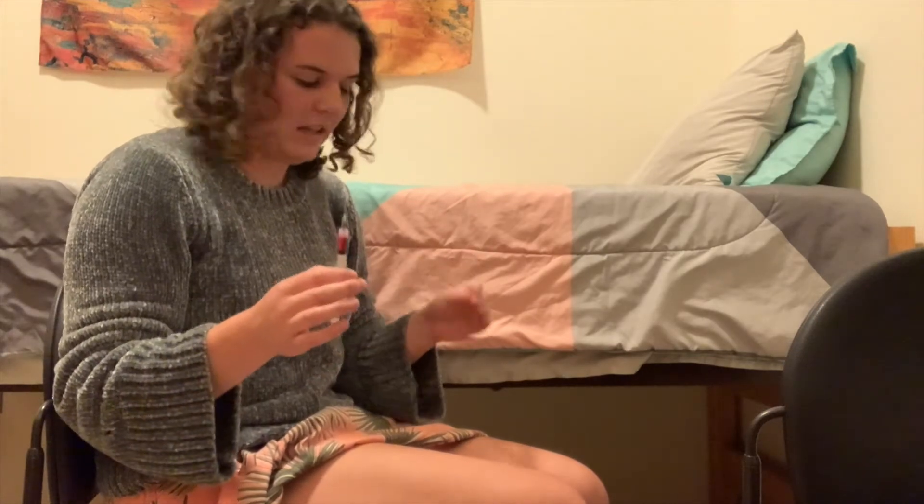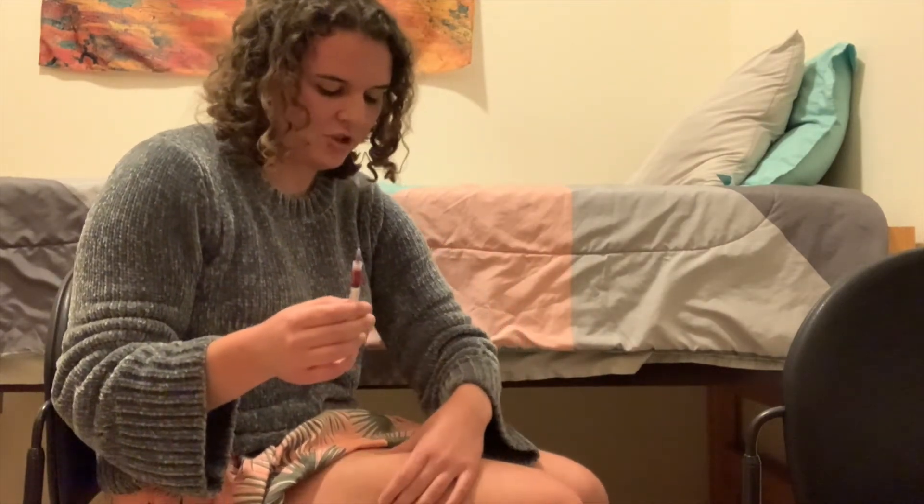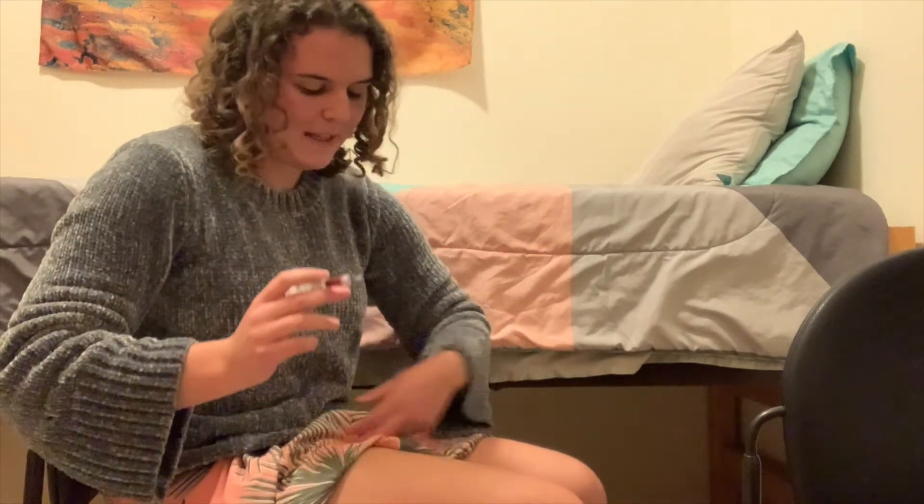Remember, we don't want to inject straight on top of our thigh — we want to go a little to the side. Make sure that your muscle is relaxed, then grab it and pinch it gently. You want to insert the needle straight down at 90 degrees — do not put it at an angle. Once it's in, insert the liquid by pushing down on the plunger slowly until it's all in. Then wait three seconds and draw the needle straight out. You shouldn't even bleed that much and it doesn't really hurt. So, my leg is relaxed, I'm going in on the side, slightly pinching. One, two, three — slowly inject the liquid. Once you have pushed the plunger fully down, wait three seconds: one, two, three. Pull the needle out and you can release your leg. And it's as easy as that.